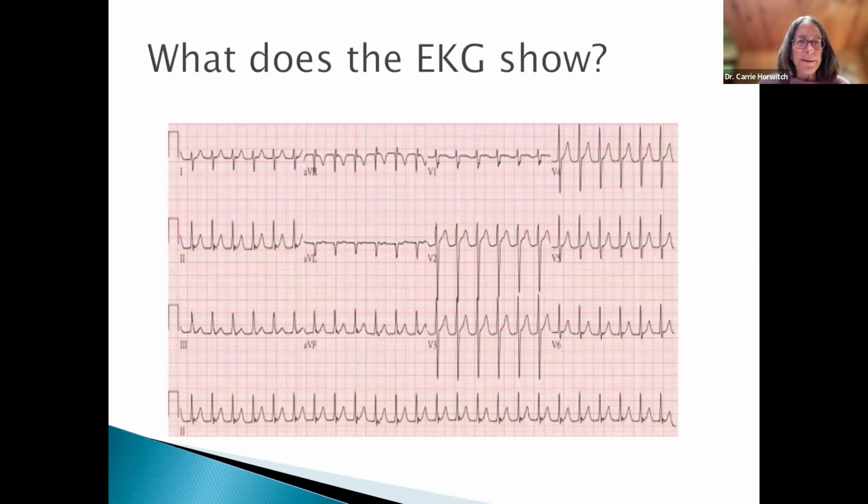So what do people think of this EKG? Well, I think everyone can agree that this EKG is fast. And if we use our counting, it's at about 150. In terms of whether this is sinus, it may be, it's a little fast. It's hard to see on this EKG. But again, because we don't really see good P waves, it could actually be further down in the thing as opposed to coming from the atrium. Okay, next slide.